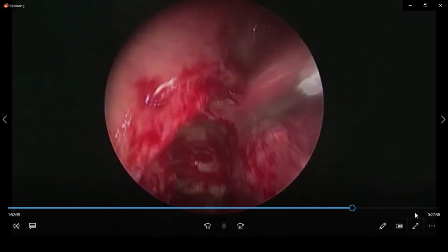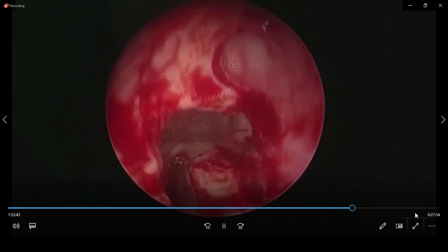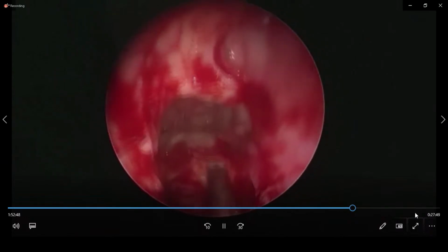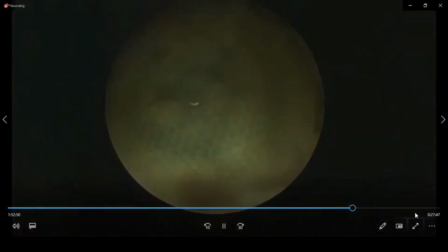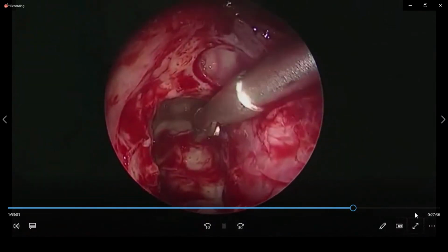Almost always you can get away with the osteomas endoscopically. Bigger one, wider attachment, you may have to cut into pieces by means of a micro drill or something, and then finally remove it. The more you make it smaller, the easier it is to dismantle it from the attachment.